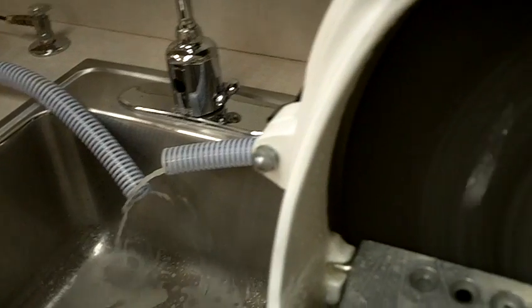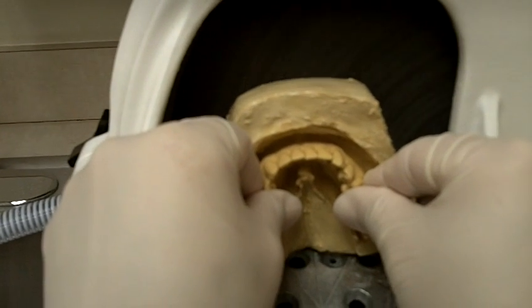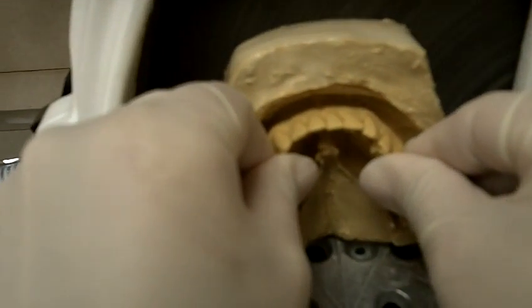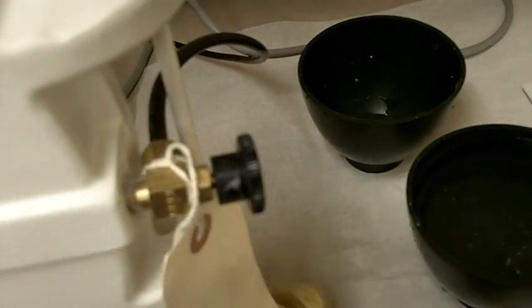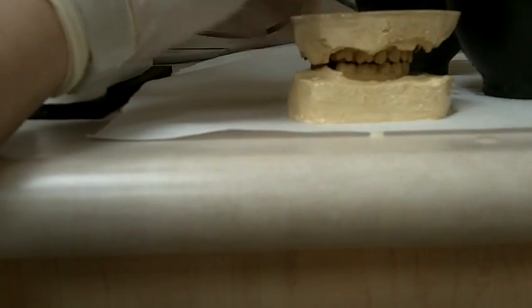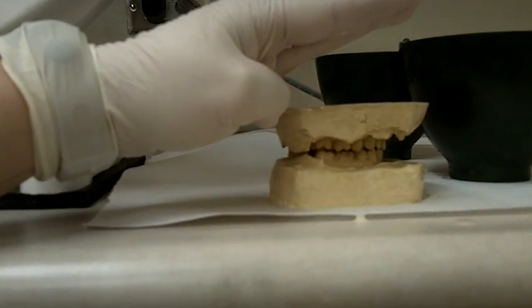Now get your next one. You want to put some pressure on it. Okay? Rinse it off. Make sure you put all of it in one so that you have the water. And then you're going to check to see if it's parallel. So you're going to come down. You're going to check to see if it's parallel to the counter. Okay, that's parallel. It's not going up like this. It's not down here. It's parallel to the counter.